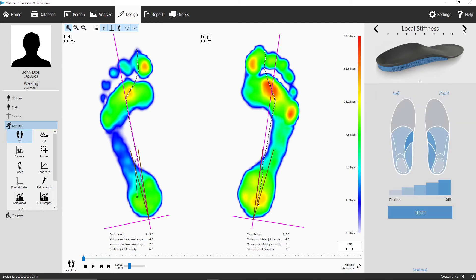Local stiffness option is a great option which shows the added value of 3D printed orthotics. Change the stiffness of the base in specific areas by clicking on the arrows, or click reset to go back to the initial suggestion based on the roll-off of your patient, considering the weight.